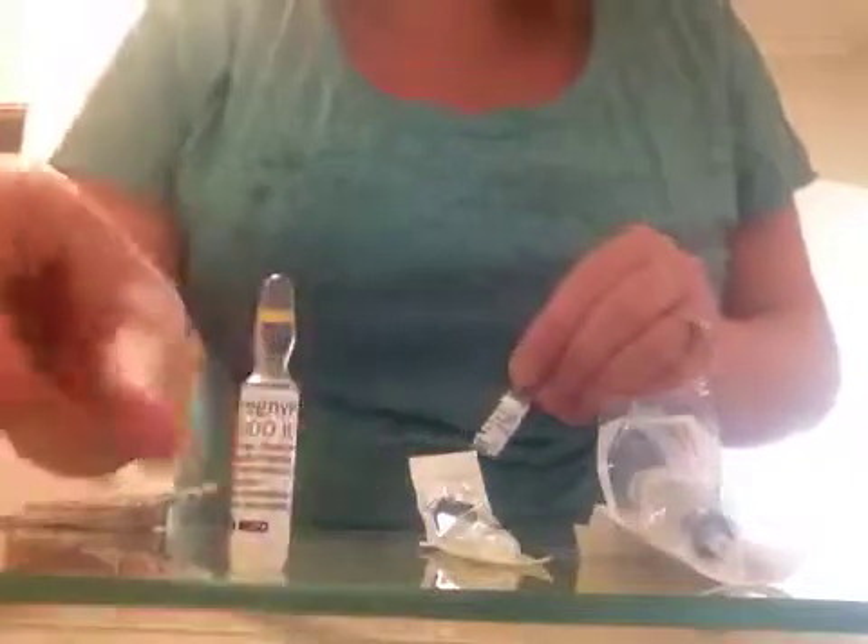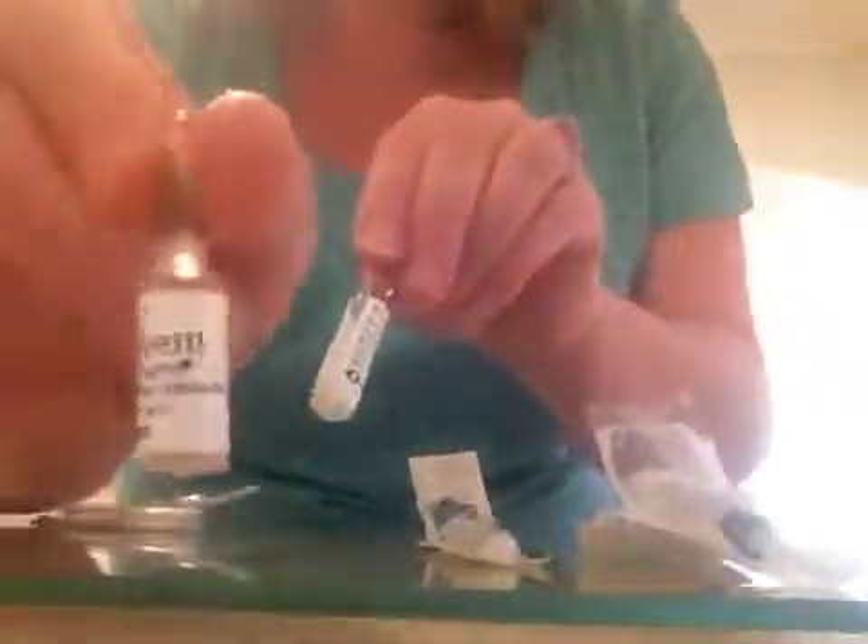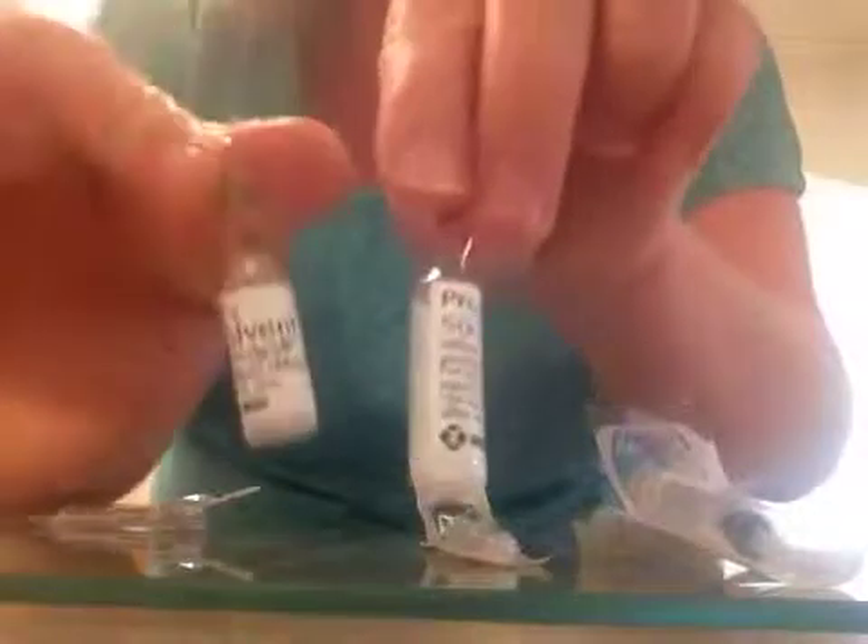So, you're going to be looking at my belly. This is the Pregnyl. They come in a glass vial — this is just the powder in here. It's all powder and you need to mix it with this, which is called a solvent, which is just normal saline — 0.9% normal saline.